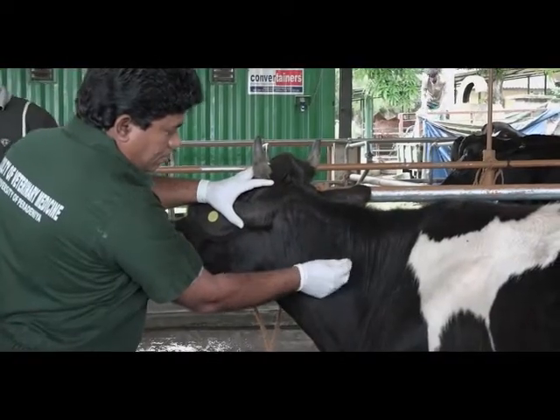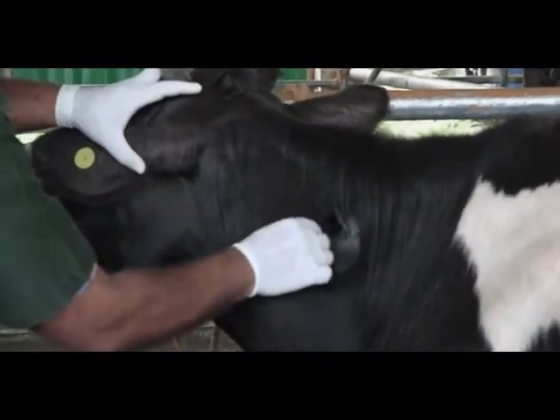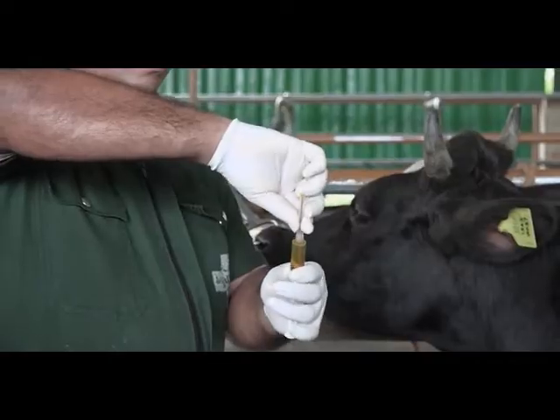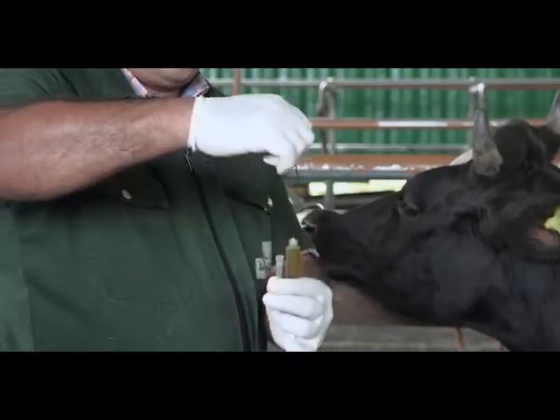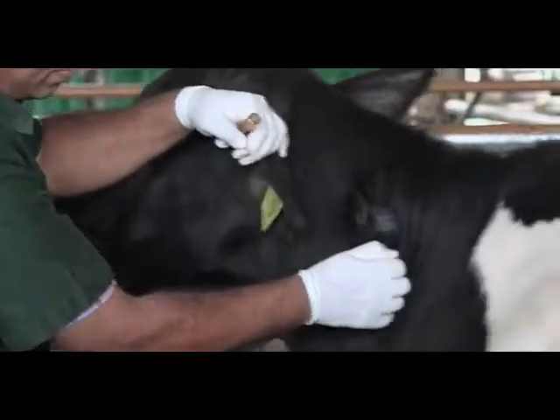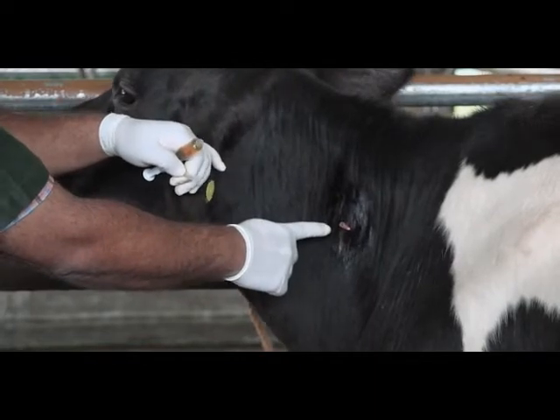Before the IM injection is given, the site should be disinfected with 70% alcohol or a suitable disinfectant in a concentric pattern from the center to the periphery. Then the 18 gauge needle is removed from the syringe and taken out from the cap with a firm grip at the hub using the thumb and the index finger. Make sure to maintain the sterility of the needle by not touching it against any surface. Then the needle could be jabbed at the center of the disinfected region.